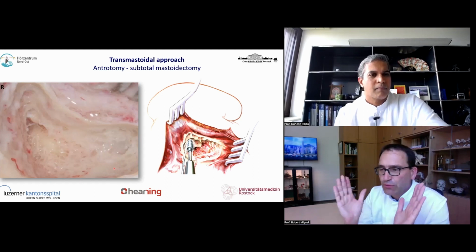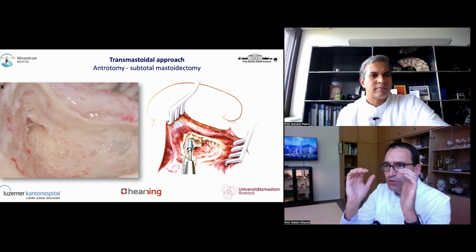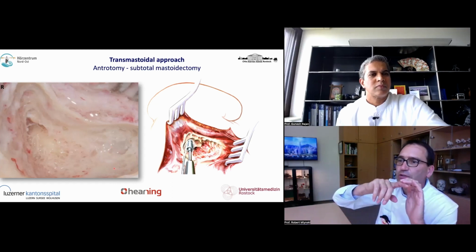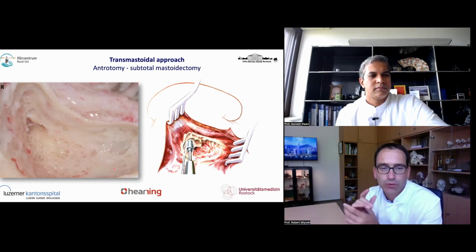In chronic ear surgery, you want a funnel that is larger laterally and smaller medially. Is that correct? Yes. Now you want to have a little bony cortical overhang, so your loop doesn't go out of the cortical bone. Yeah, that's an important point.